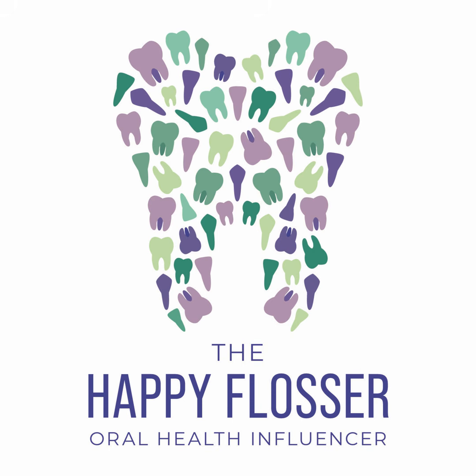You don't want to have it set up right in the tray before you even come near the patient because your water temperature was too warm and it sped up the setting time. Don't be afraid of the fast set alginate. If you use nice cool water and you know that your tray fits and you're managing your patient okay, the fast set is plenty of working time to mix that alginate up into a smooth pudding-like consistency, put it in the tray and seat it in the patient's mouth. You have enough time, so don't shy away from that. I would highly recommend you test the waters there.